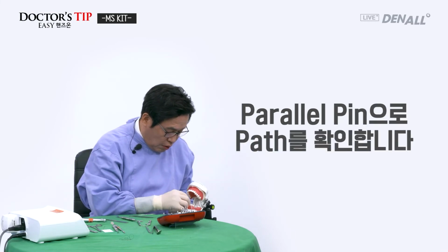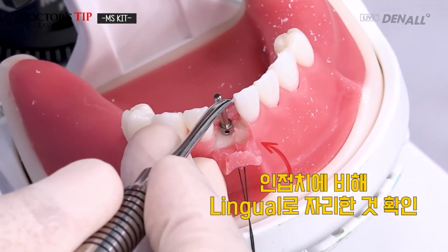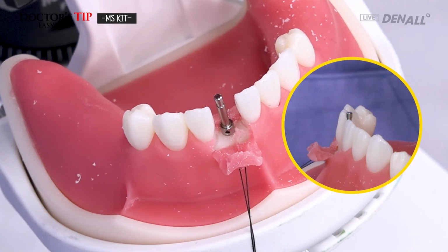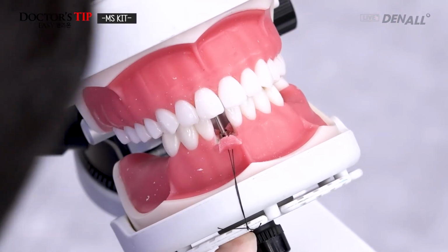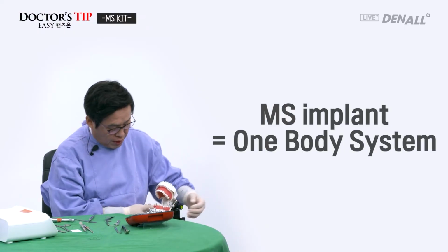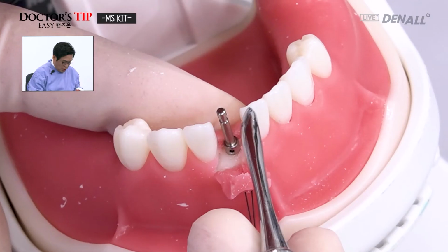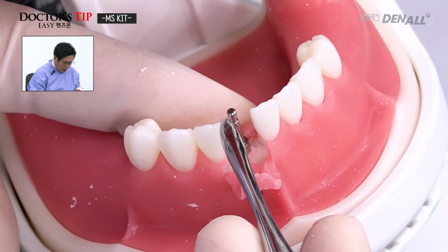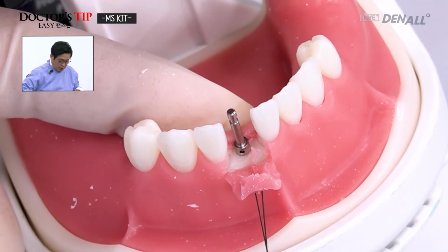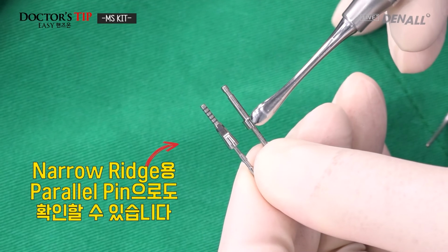I used a parallel pin to check the drilled position, and as you can see on the mandible anterior side, compared to adjacent teeth, it's tilted about 0.5 to 1 millimeter toward the inside. Unlike this, you check the positioning, and on the upper side, on the lingual side, it's the correct position. And again, this is a one body implant, so the path is important because you cannot change it with an abutment. And like this, in the adjacent teeth, you check against the incisal edge line. So about 0.5 to 1 millimeter, it's tilted toward the lingual, and on the longitudinal axis, the path is like this, and this is the guide pin.